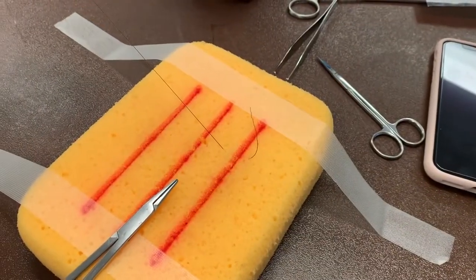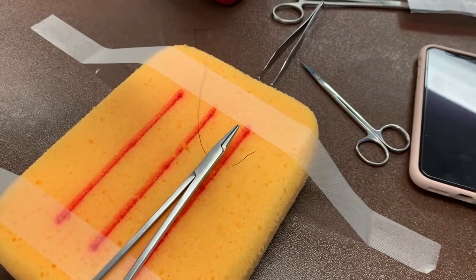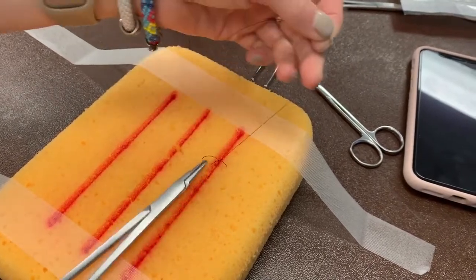Start by pulling the suture until the tail is very short. A surgeon's knot begins by looping the strand with the needle around the driver twice. Then grab the tail of the suture and pull it through.